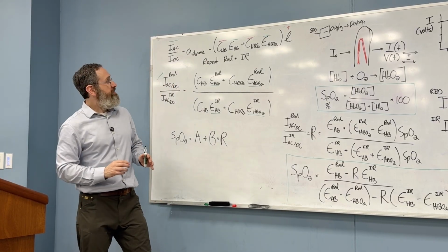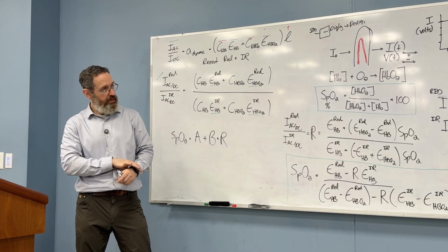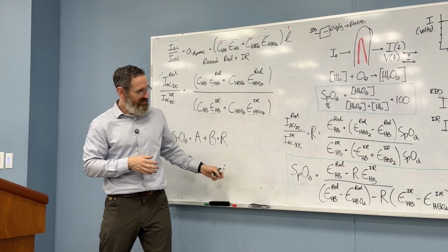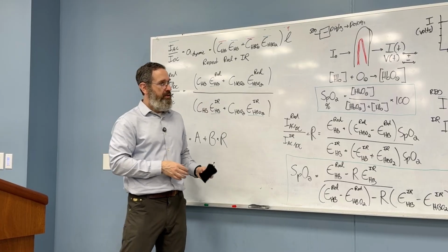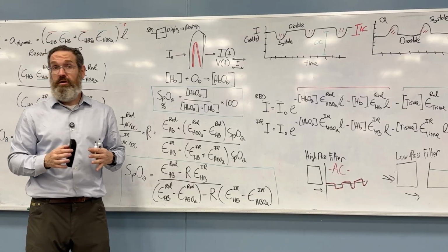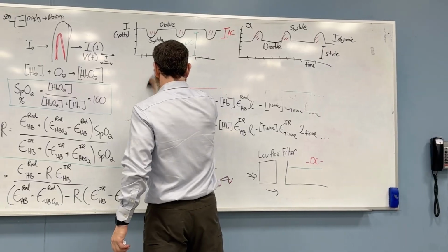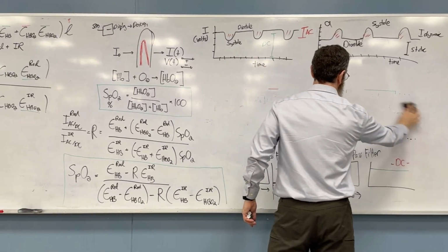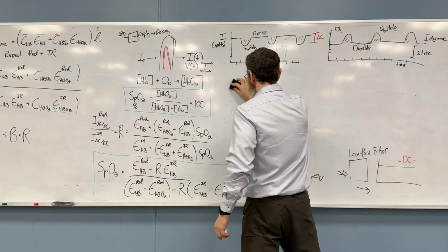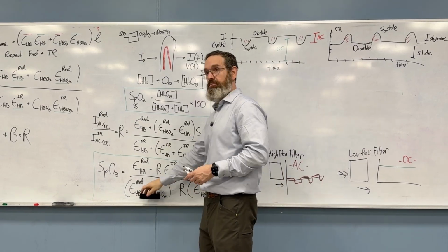All right, but there is something else. I'm just going to give you one more nugget. This is nice, but there's something else that I didn't tell you about that pulse oximeters do that to me is kind of interesting in itself. So it turns out Beer-Lambert doesn't hold for biology, because nothing holds for biology, right?